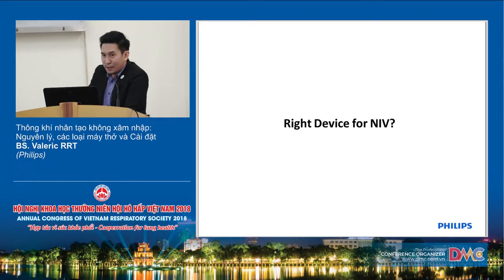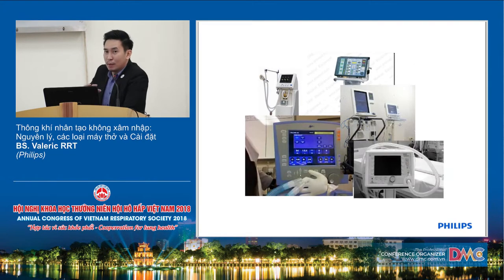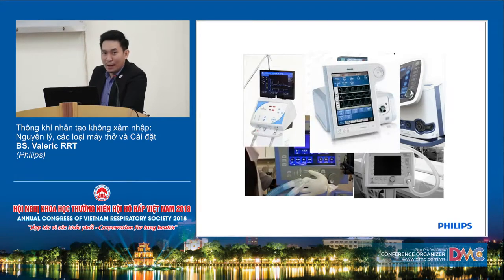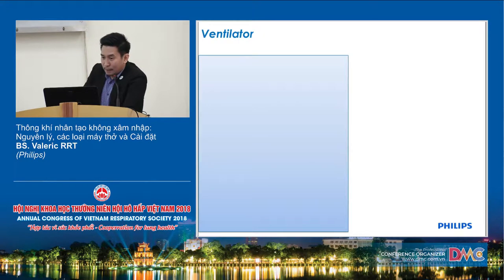Okay, so what is the right device for non-invasive ventilation? Nowadays, most ventilators on the market offer both non-invasive and invasive ventilation approaches. So which kind of device is best for non-invasive ventilation? According to research from Spain, unfortunately not all ventilators perform the same way, as per Professor Belda from Spain.